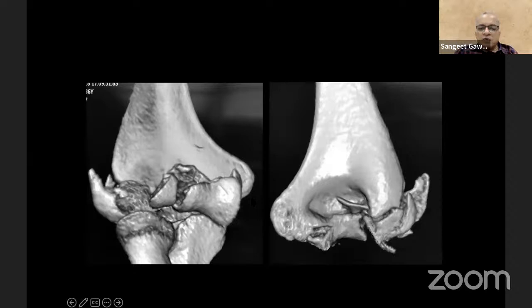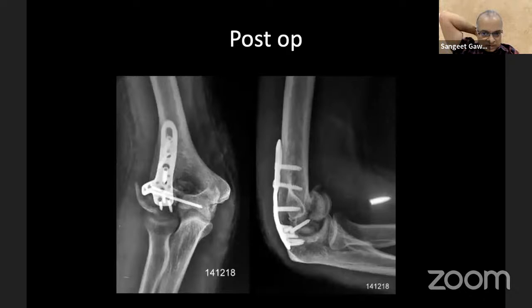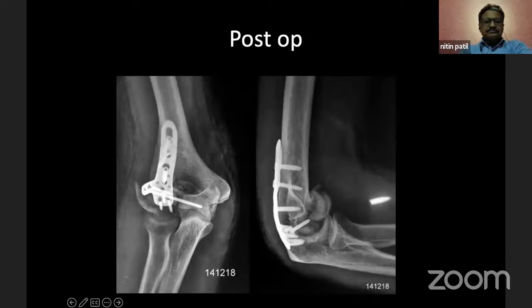Where you can see what Asim has spoken, the lateral column. On the right side is an image from behind, where you can see the entire lateral condyle is comminuted. It is fractured. Apart from that, if you see the left side picture, there is a shear fracture of the comminuted capitulum and the entire trochlea. It has moved in front. Okay. So, this is how it was fixed. So, is it okay? No, sir. Any comments? No, sir, the capitulum is lying in front.